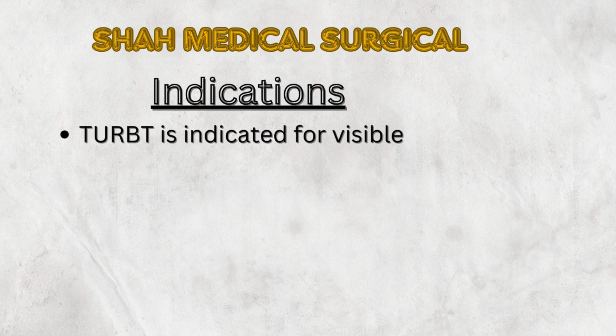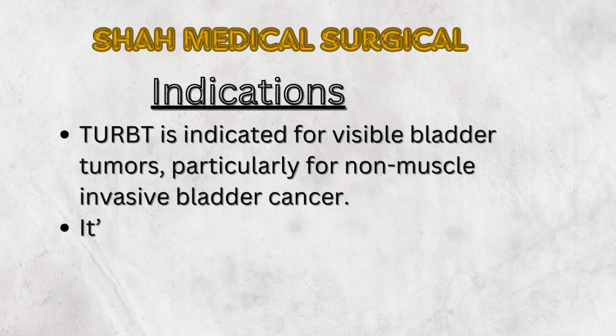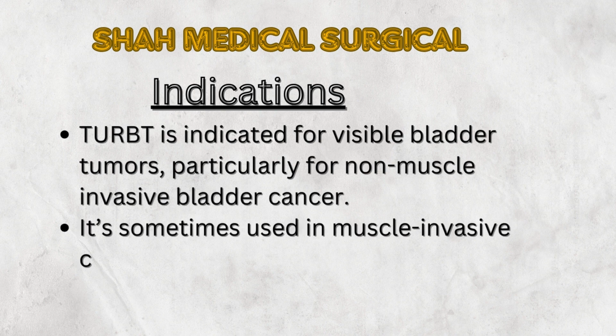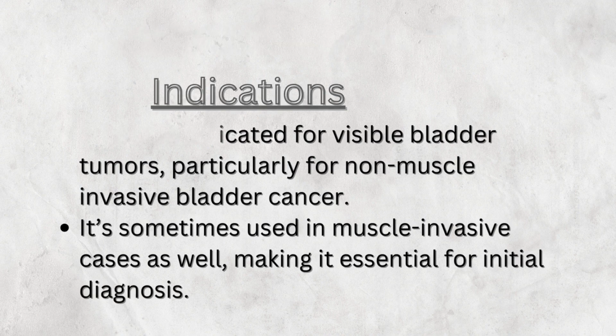Indications. TURBT is indicated for visible bladder tumors, particularly for non-muscle invasive bladder cancer. It's sometimes used in muscle-invasive cases as well, making it essential for initial diagnosis.